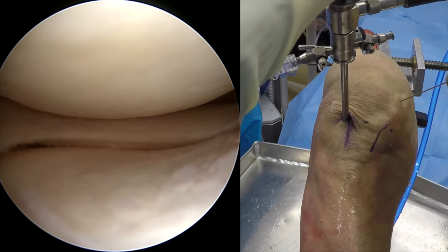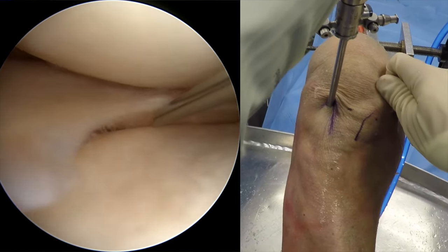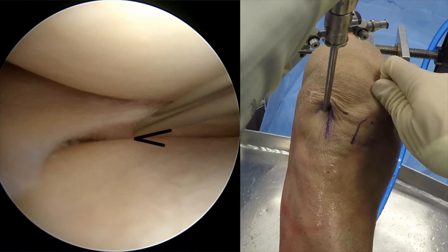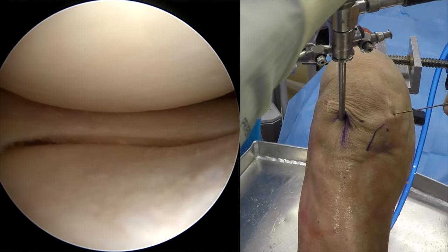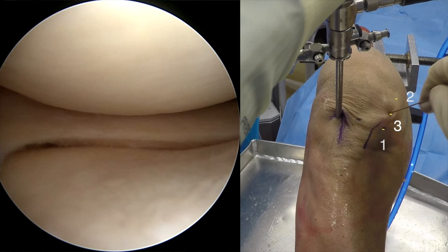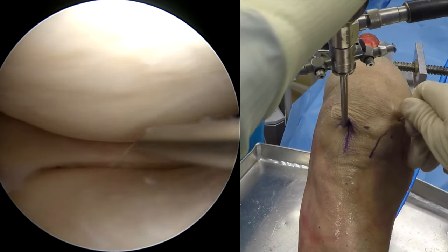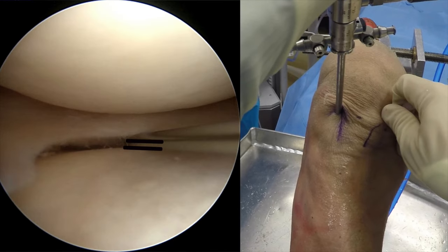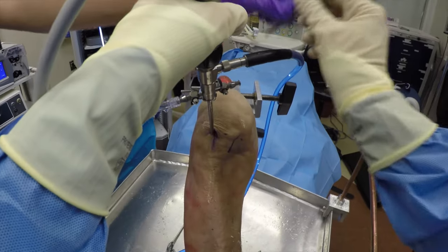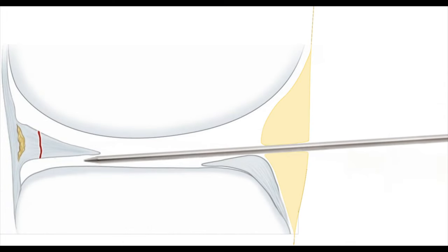Now let's try a higher location — we'll call this number two. As this one comes in, you can see that it's clearly too high and the vector formed between the spinal needle and the posterior tibial plateau is convergent. So let's try something in between those two — right here, we'll call this number three. You can see that this skin incision spot gives optimal access to the posterior horn of the meniscus and forms a vector between the undersurface of the meniscus and the posterior tibial plateau that is parallel. This is where I'm going to incise. It doesn't matter if you make your incision vertical or horizontal. Then the trocar is used to confirm that the vector is a straight shot to the space between the meniscus and the tibial plateau posteriorly in the region of tearing.